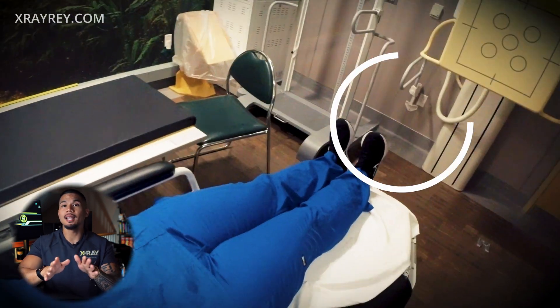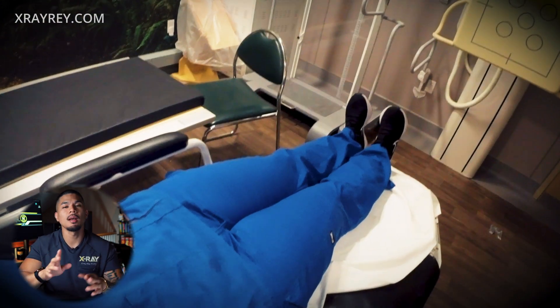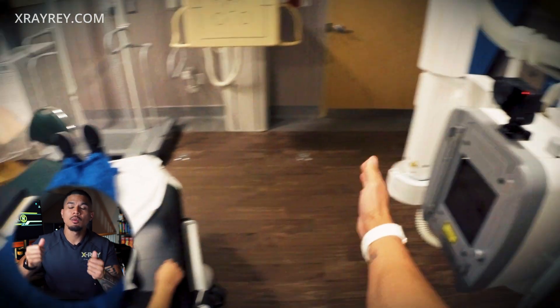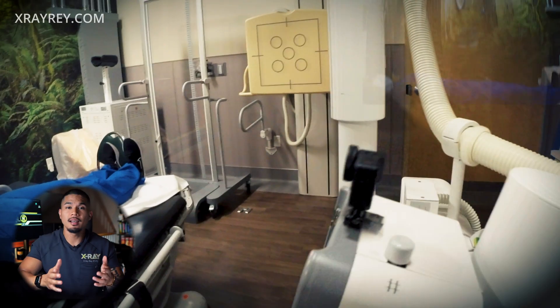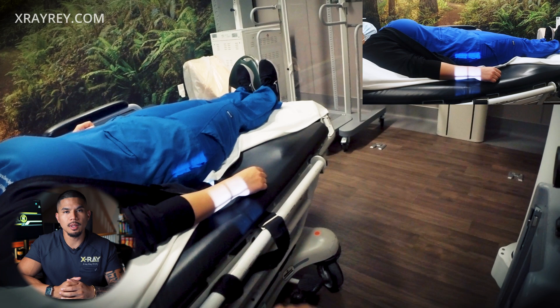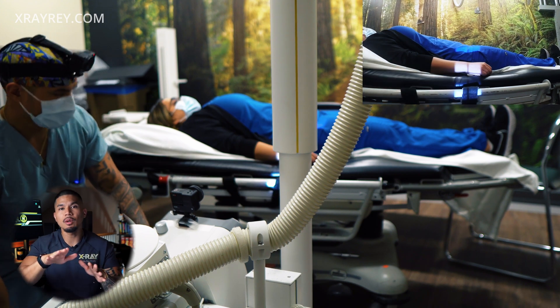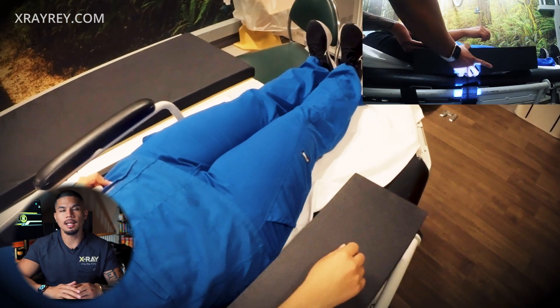Technically you would be right, however you'll run into an obstacle. But before we get to that — I turn my bed so the patient's arm is perpendicular with the tube. This may look like a minor step, however it's important because my tube doesn't rotate in small increments. This one I'm using rotates in increments of 45 degrees, so it'll be very difficult to match my tube to my patient's arm. But because I'm able to freely rotate my patient on the bed, this is the best option. Now since she's not able to rotate her wrist, it's not going to be a true lateral. So we just angle the tube, right? Yes and no — if we just angle the tube, the bed will be in the way. So we must prop her arm up to get it high enough to clear the bed.